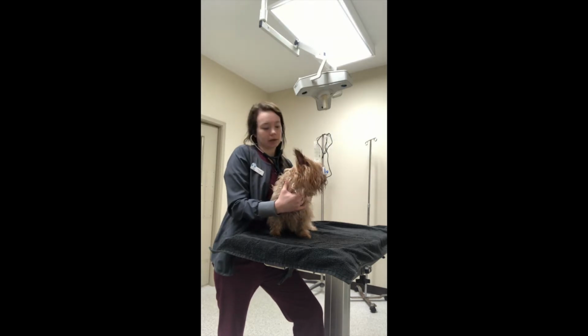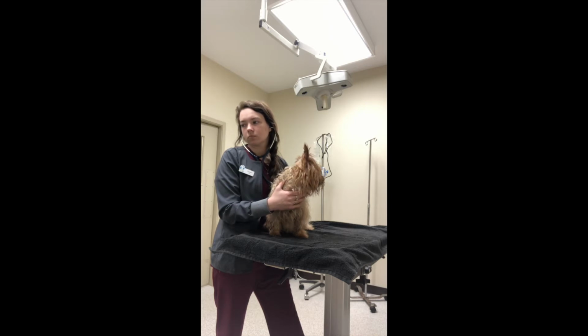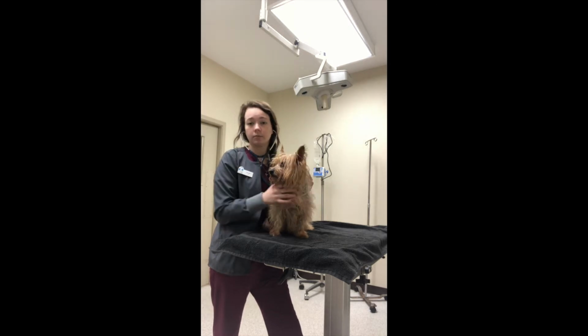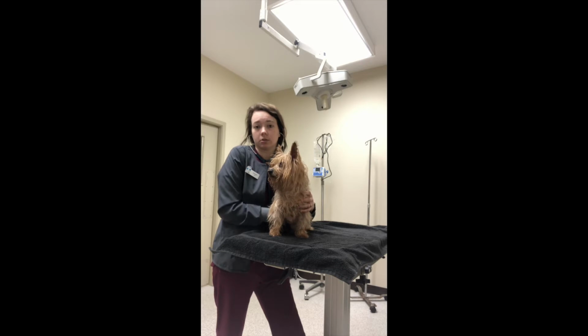Then I'm going to get a heart rate, so I'm going to count the beats within 15 seconds and then multiply it times 4. Okay, so there was 25 beats within 15 seconds, so the beats per minute is 100. And any abnormalities that you're going to listen for are swishes between the heartbeats. That would indicate a heart murmur, and then you would report that to the doctor.